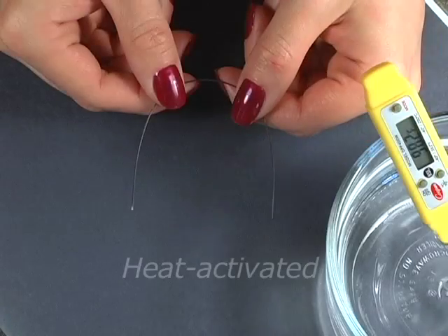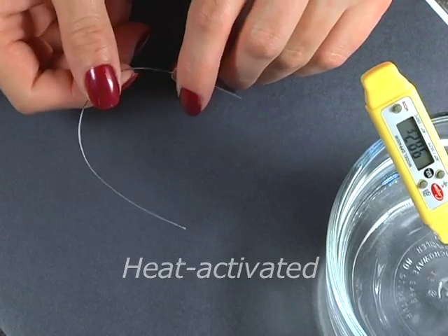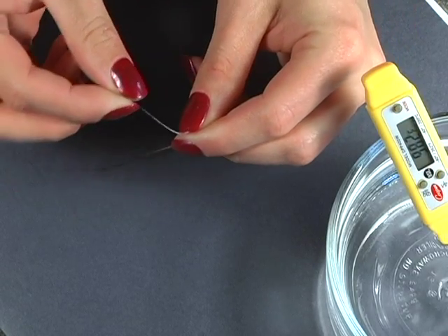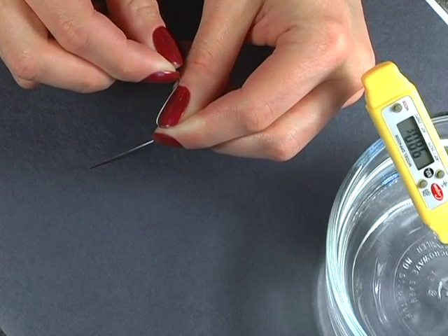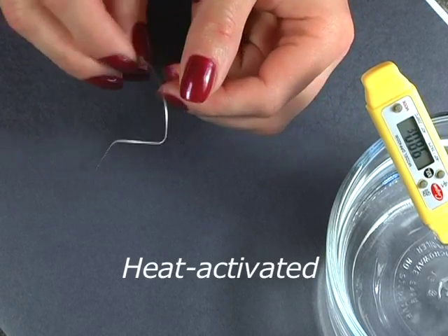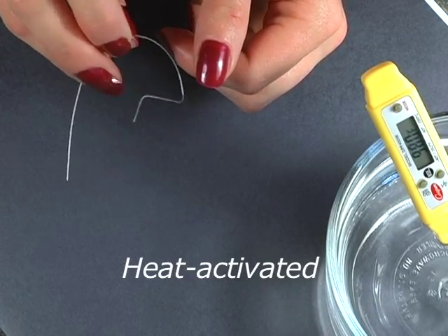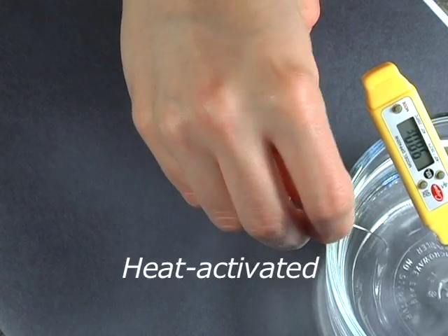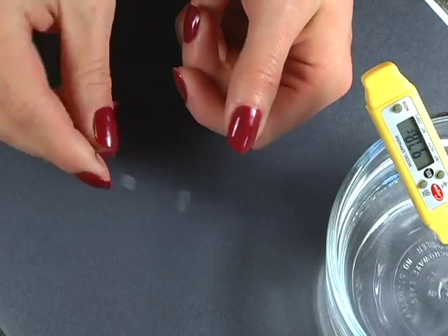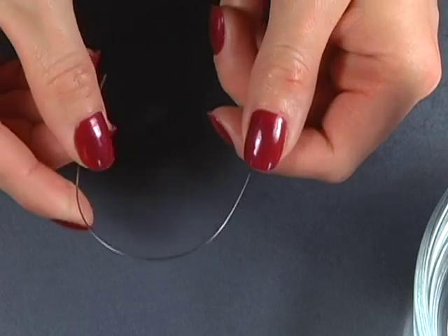Now, let's compare how a heat activated wire with shape memory responds to the Z test. This is a heat activated wire of the same cross section as the super elastic wire we just tested. Again, grasp the wire as before and gently bend into the Z shape. Note that it feels much softer and more pliable. Now release with one hand. This is a heat activated wire and so exhibits shape memory characteristics — it maintains its bend at room temperature. The remarkable thing about heat activated wire is that once exposed to heat, such as body temperature exemplified here by a 98 degree Fahrenheit water bath, the wire will come back to its original shape. It should be pointed out that while their force is low at room temperature, thermal heat activated wires exhibit measurably more force at body temperature.